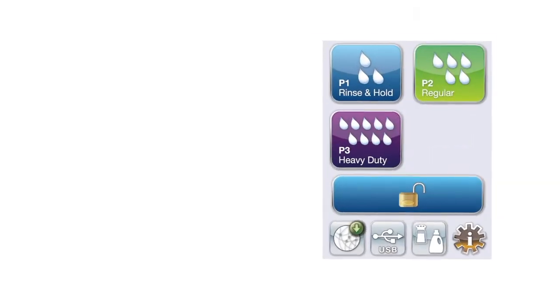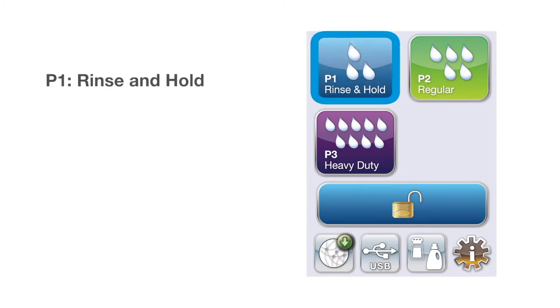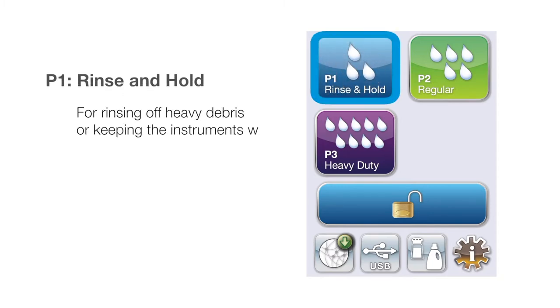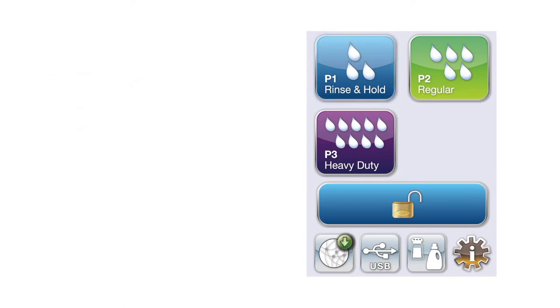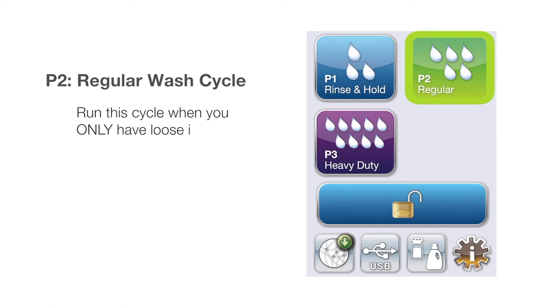Hydrum comes with three pre-programmed cycles. P1 Rinse and Hold for rinsing off heavy debris or keeping the instruments wet. P2 Regular Wash Cycle. Run this cycle when you only have loose instruments and no cassettes in the Hydrum.